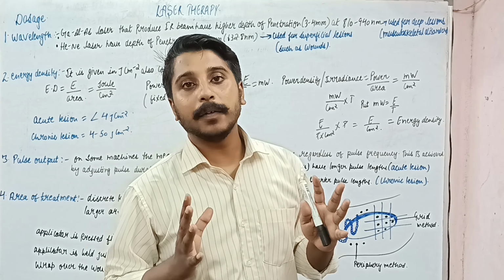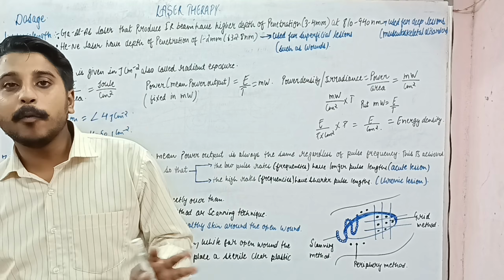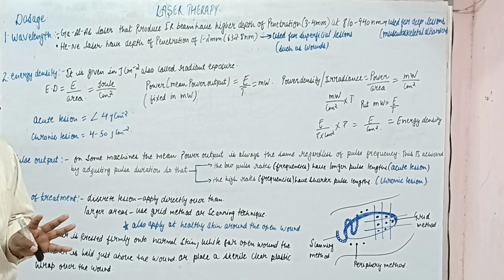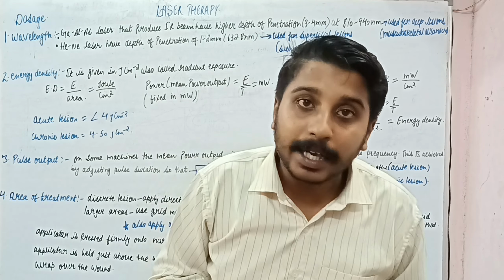We are back with our next lecture on laser therapy, and here we are going to study about the dosage. How are we going to set the accurate and most appropriate dose for an individual? My name is Vijay Kumar, and let's get started.